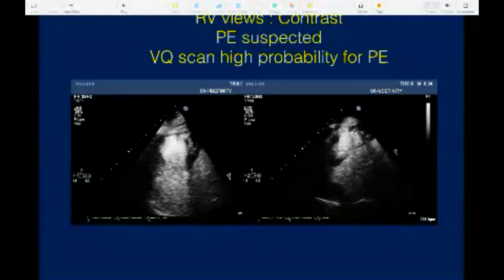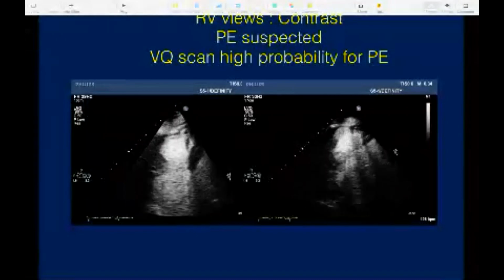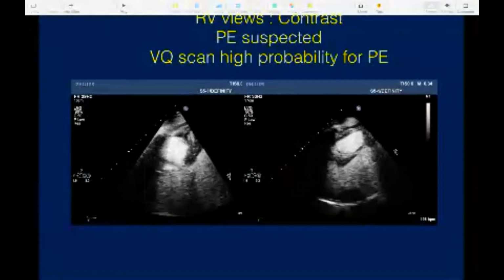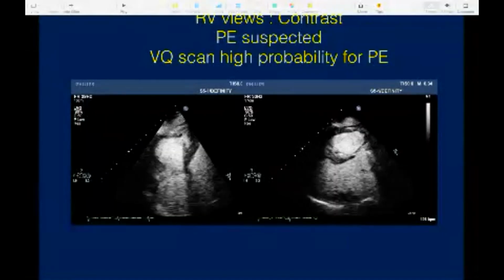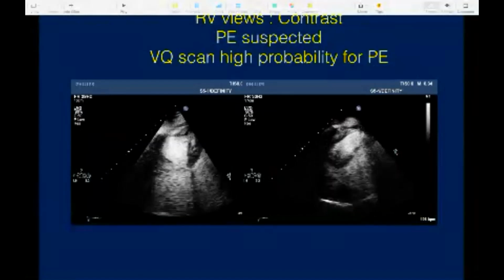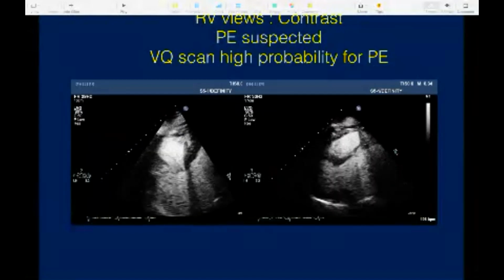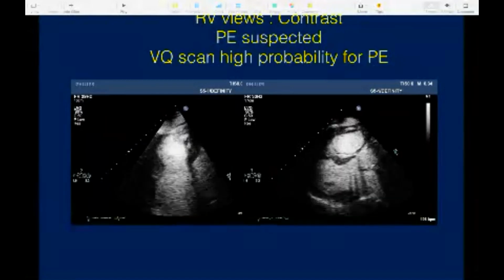So I think the cost implications and unnecessary exposure of patients are definitely against routine use of contrast. But in cardio-oncology, the implications for patient treatment are high enough that that's what we do. We try to do contrast in literally all patients, unless there's exquisite imaging, in which case we routinely do 3-dimensional ejection fraction.